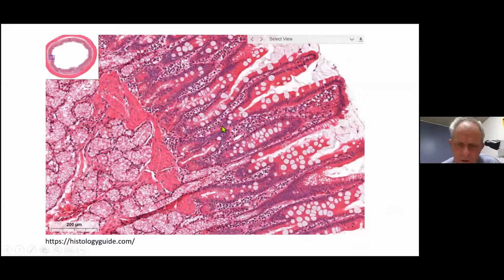If you look at this here, you've probably got 3 times, maybe a little bit less, 2.5. But you can see that the distance between there and there is of the order of 2.5 to 3 to 1. And usually if you've got duodenal atrophy, it decreases quite considerably. And I wouldn't be too concerned.